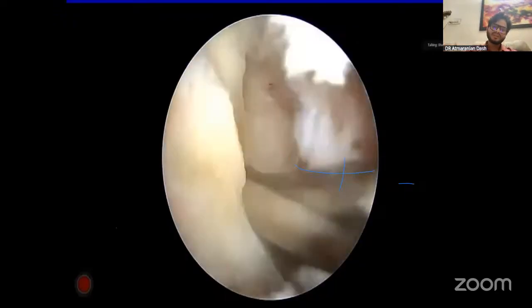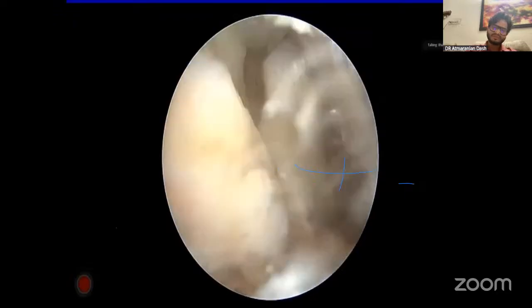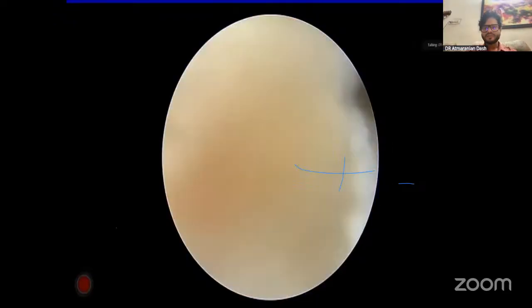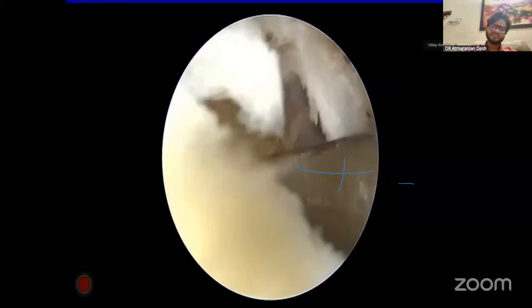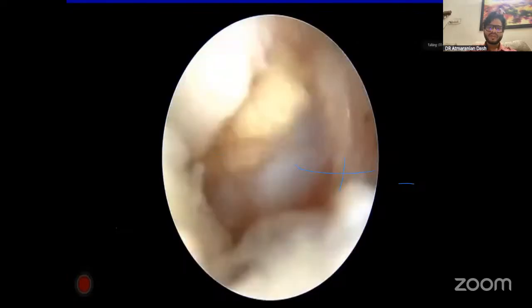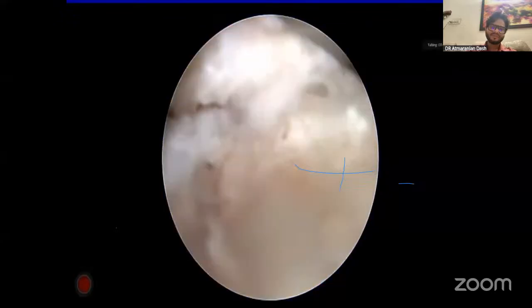So this is the chisel. This is the curved chisel. I use this curved chisel a lot because it is used for removing the small lips of the cranial border of the caudal lamina. Now you can see I have removed the attachment of the flavum. Now the dura is visible. I am trying to remove that flavum. You can see the flavum is removed from this attachment.